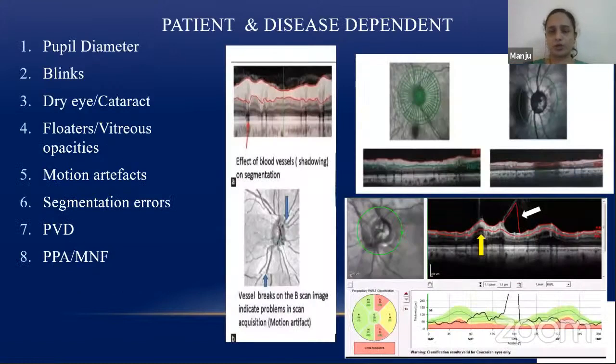Pupil diameter is usually not affected by the current SD OCT scans, but if you get any artifact with the normal pupil size, better to dilate. Blink causes transient loss of the data. So ask the patient to blink physiologically just before the acquisition of the scan.